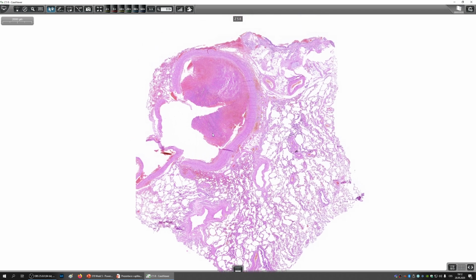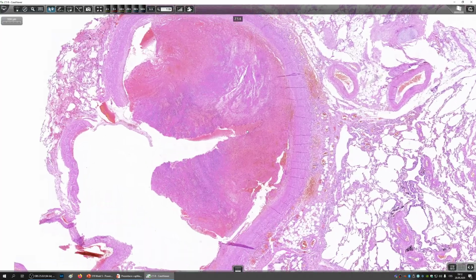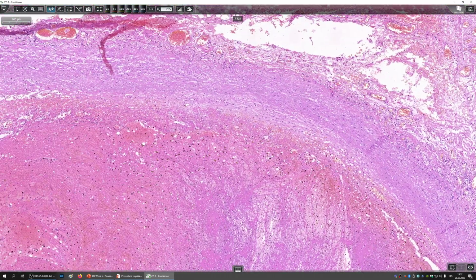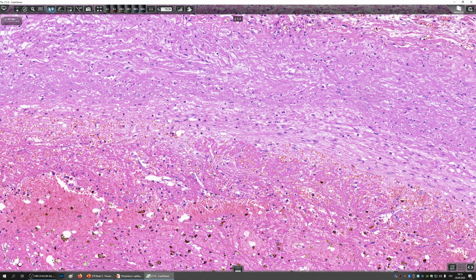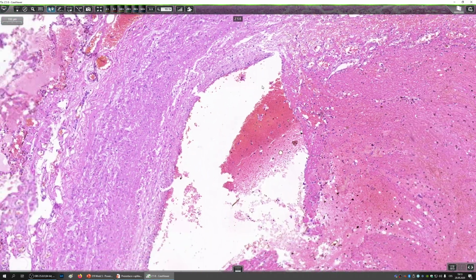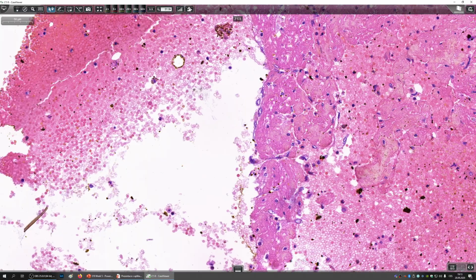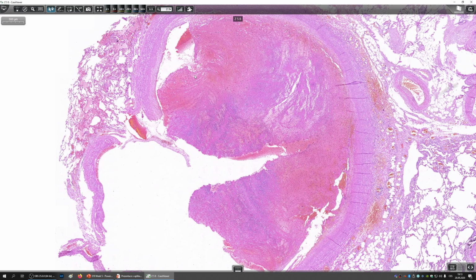So here we have a case where the thrombosis has happened. Here's a relatively fresh thrombus. We check for organization, if there is any. There is a very minimal organization at the periphery. So the patient has survived, let's say maybe a week with this thing. The patient has survived a little bit, but here is the organization. Here you see the blood vessels growing into the fibrin mesh of the fresh thrombus. So this patient has survived for some time, but unfortunately the patient has died of it.